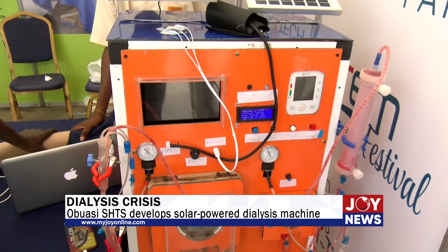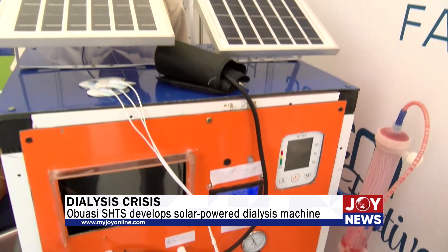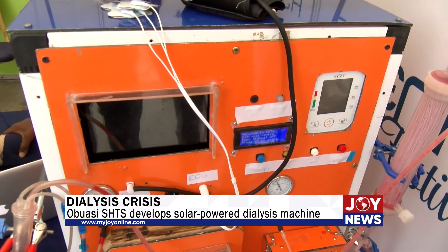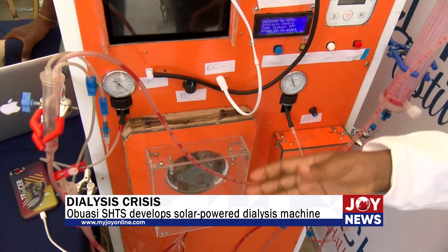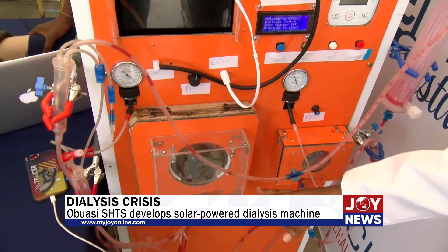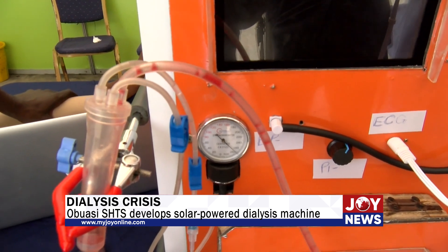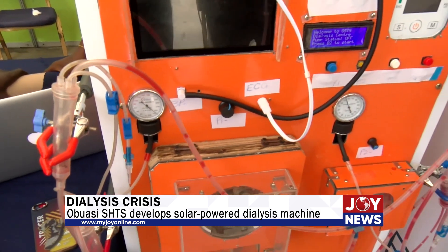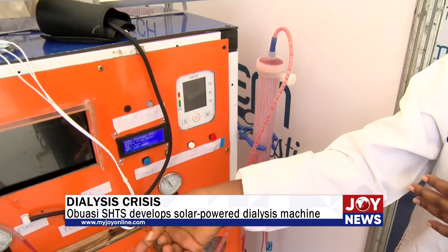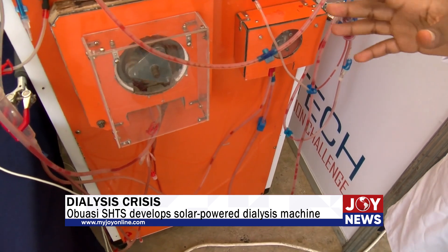My name is Pressler Sampaman. I will take you through how the whole thing works. So as she mentioned, the contaminants are stored in the patient. We have two tubes — the red one and the blue one. The red one will take the contaminated blood from the patient through the peristaltic pumps to the dialyzer, where the filtration will take place. The blood is filtered there and the contaminants will remain in the dialyzer. The filtered blood will pass through the blue tube back to the patient. So it's a continuous cycle, and it will take about four hours for all the contaminants in the patient to be removed.